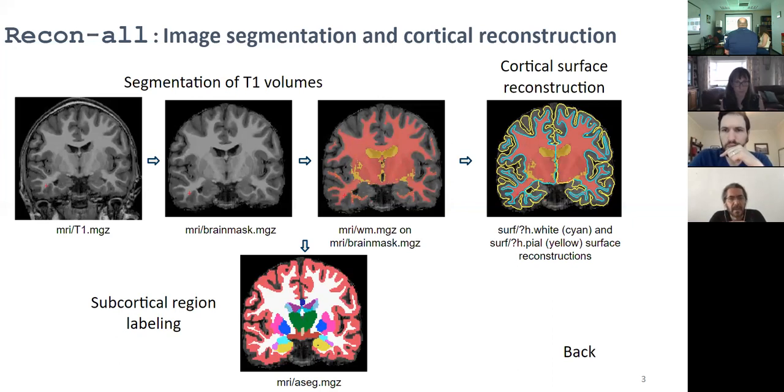I don't know the physics of this, but T1 and T2 have the same kind of spatial deformation type of noise. So this is not like EPI versus T1, where they have completely different distortions. So when they are working with these multispectral images, they still don't have to deal with spatial deformations between them. They assume them to be exactly the same, right? I believe that they do not have to deal with that. So in terms of deformation, those are similar.